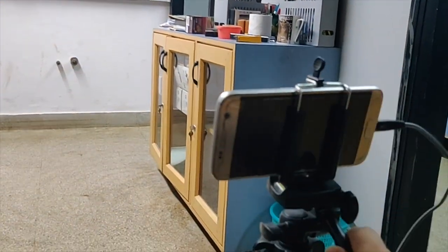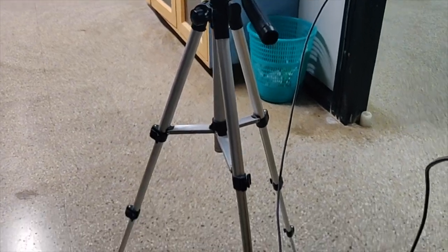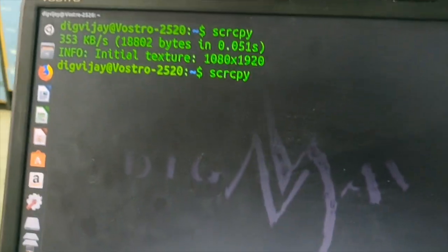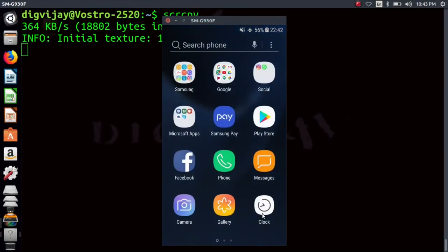So to start with, we require an Android phone with a decent camera, and as you all know, most phones come with a good camera setup, so that should not be an issue. We need a stand and a USB cable and a laptop running Mac, Windows or Linux. I'm using an app called scrcpy here, which allows me to control my phone from my laptop itself, as you can see.